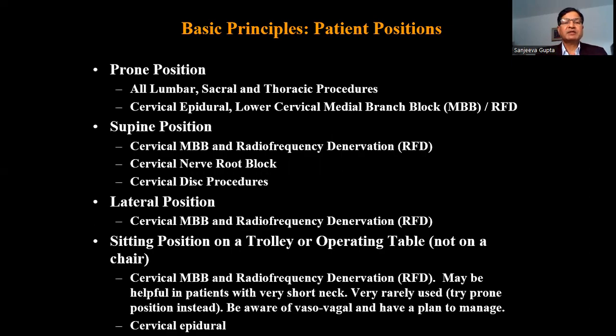Patient position is also extremely important. As I said earlier in my first presentation, all lumbar, sacral and thoracic procedures can be done in prone position. Cervical epidural and cervical medial branch block and RF can be done in prone position. In supine position, cervical medial branch block and radiofrequency denervation, cervical nerve root block, and cervical disc procedures can be done.